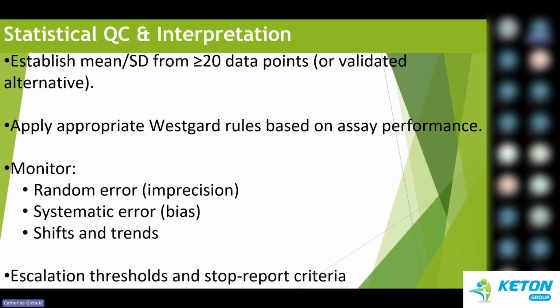What the ISO has advised, especially for the EQA, is that you stop and make a correction, and you don't just correct and move on. You go back, check a few samples, and even recall those that you are able to.